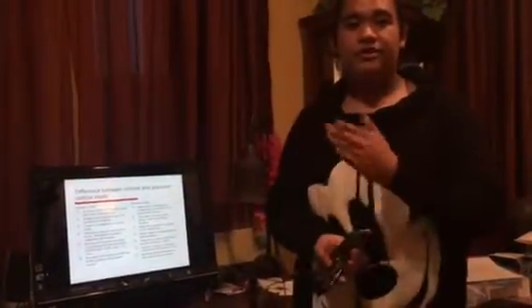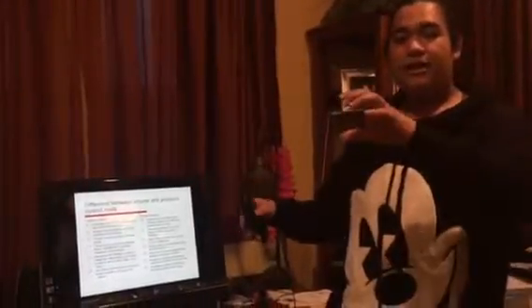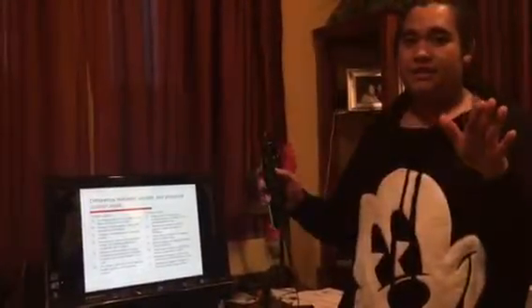And then peak pressure on volume control will vary, because we're giving a variety of pressure. So the pressure is not constant. That means that the peak pressure is going to be variable, or it kind of fluctuates. As for pressure control, peak inspiratory pressure will be set. When you put 20, the PIP will just be 20, and that's it.